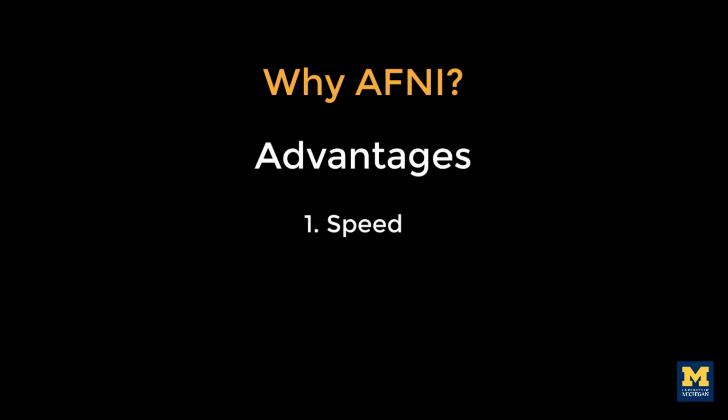One, it's fast. AFNI is able to do many processing steps very quickly and is especially effective at quickly estimating models. Two, it's flexible. Each of the major packages offers some degree of flexibility, but in my experience, AFNI's code is the most transparent and customizable.